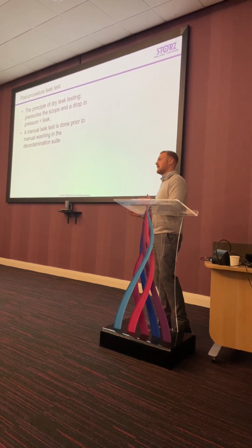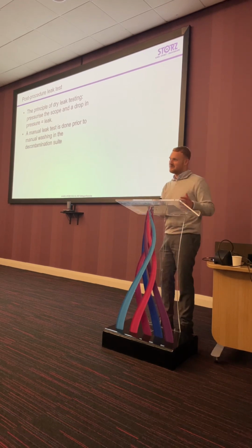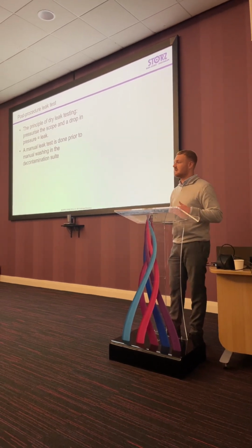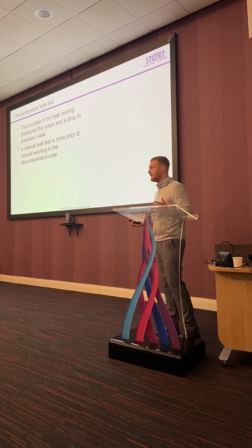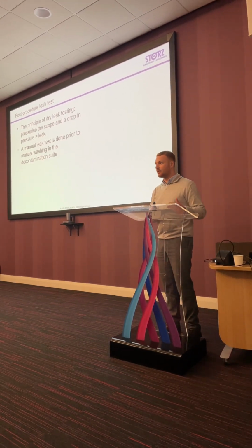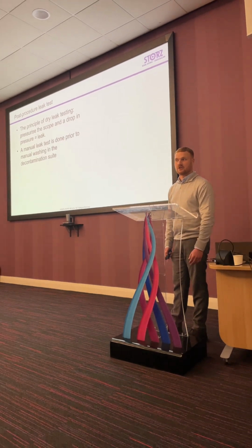Because we all know how it works, where the scope leaves you guys, goes down to HSDU, they say it's leaking, you say, well, it couldn't have been leaking from our end, must have been your end. They say, no, it must have been your end, and we just go round and round in circles. But doing this after a procedure, keeping a log, keeping a register, gives you the peace of mind that when it's left you, it's completely been fine, there's no leak. And then it also helps us because we know where to train and where to support, to make sure that we're nipping in the bud any issues before they become out of control. Okay.